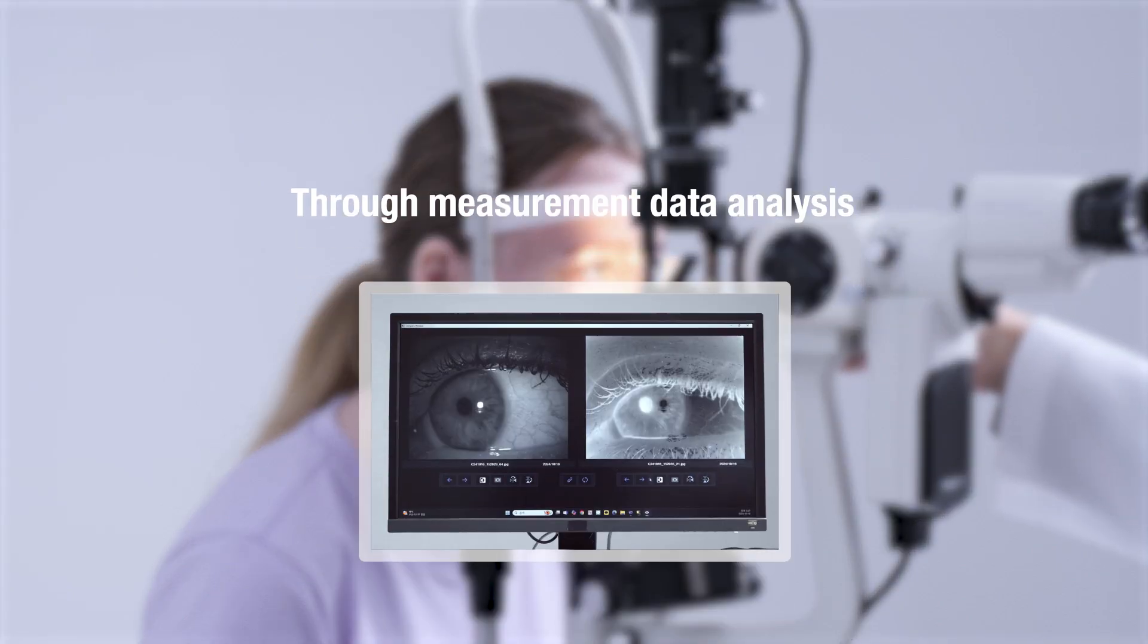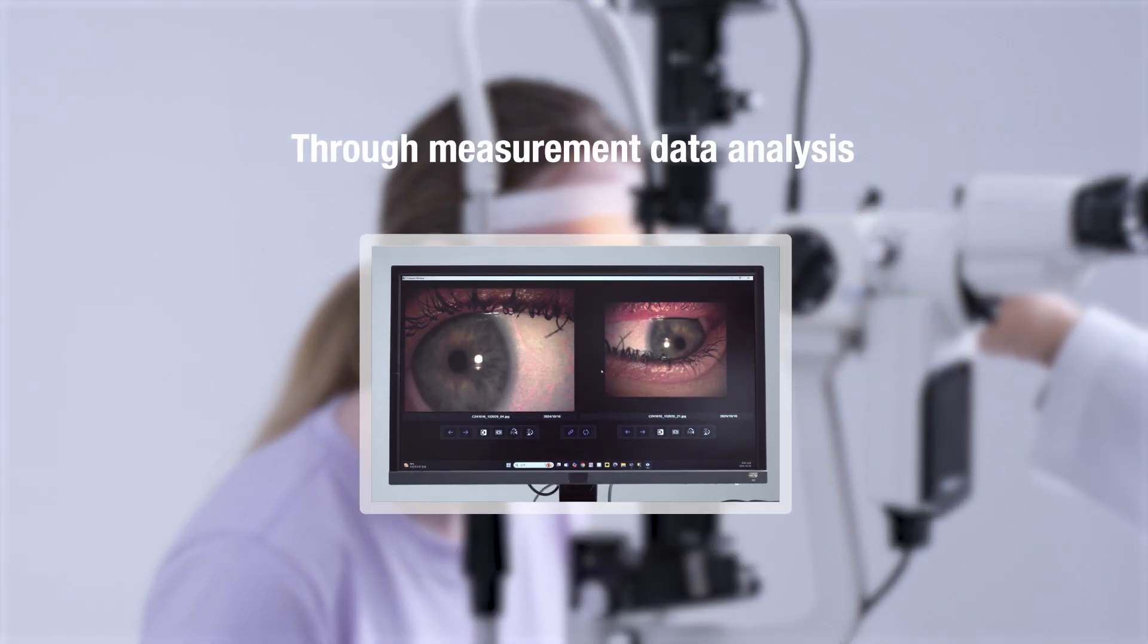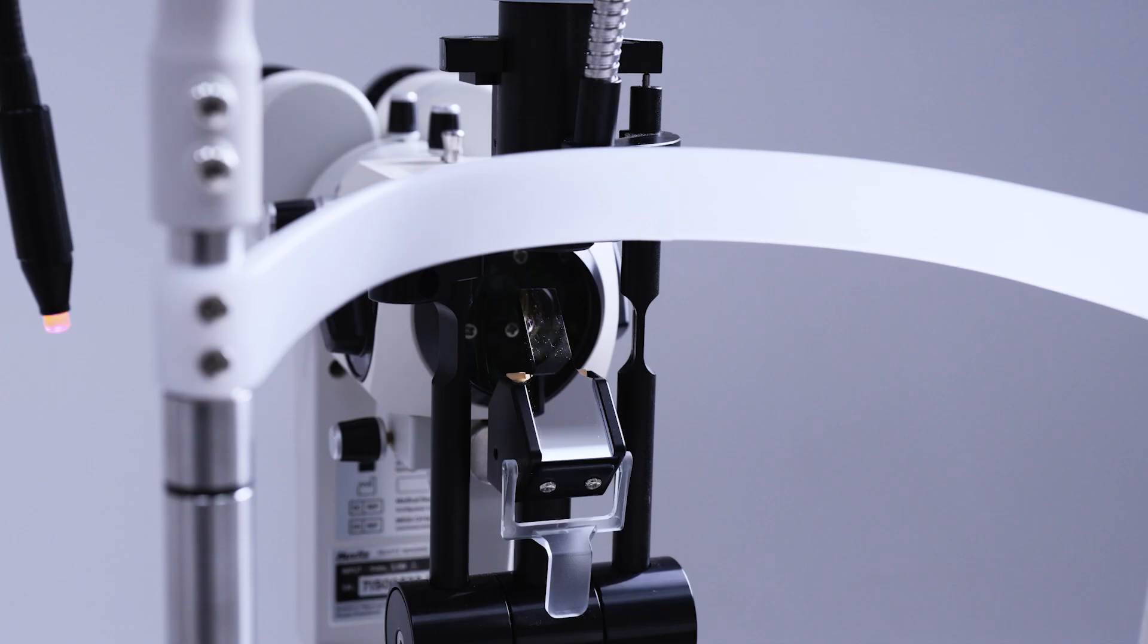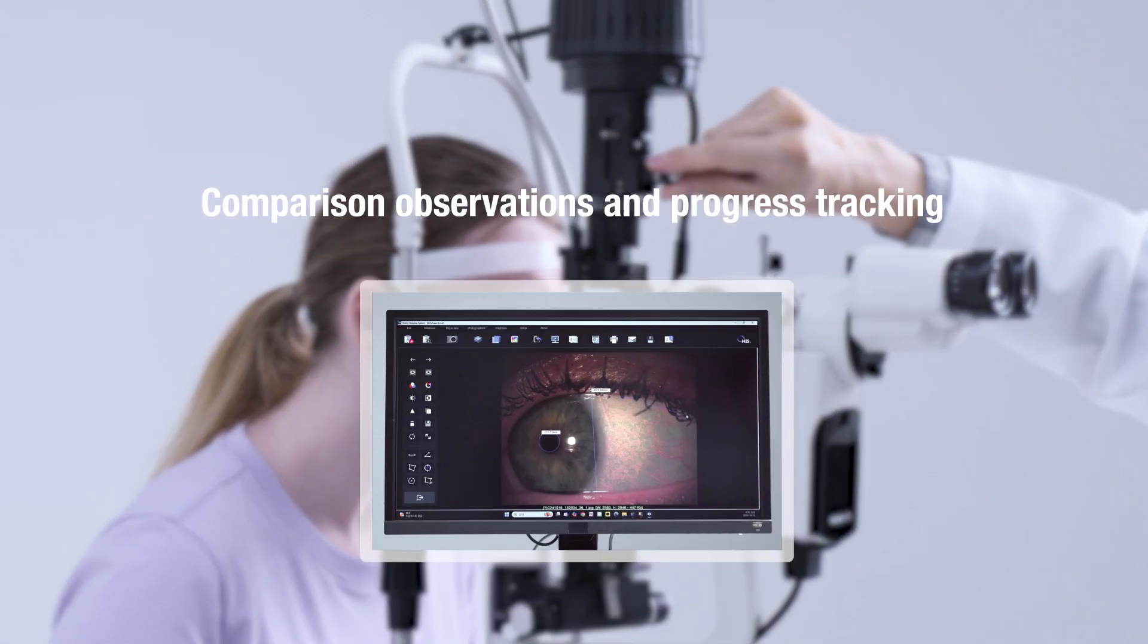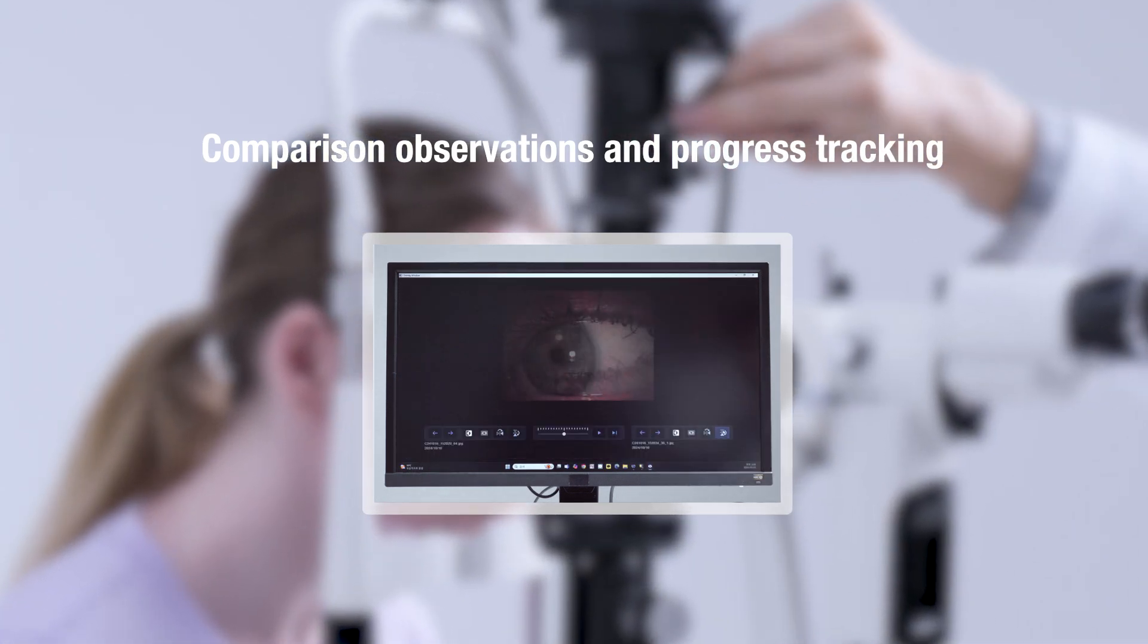Additionally, through measurement data analysis, you can verify comparison observations and the progression of diseases.